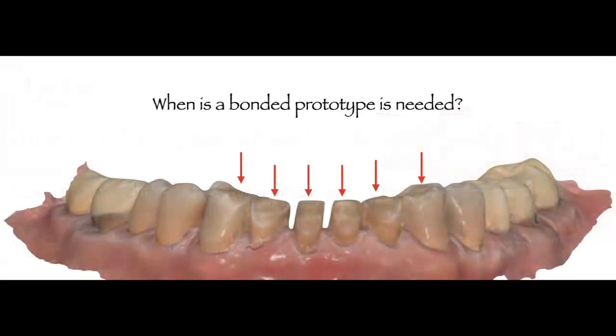Well, I want to start by sharing with you this scan of the case that I'm going to share with you today. As you can see, the patient presented to the practice with excessive attrition and erosion on all mandibular incisors and attrition on the cusp tips of the mandibular canines. Now, I also want you to see, and I'm pointing here with my cursor, that the pulp chamber at this point is very close to being exposed. All these teeth are vital.